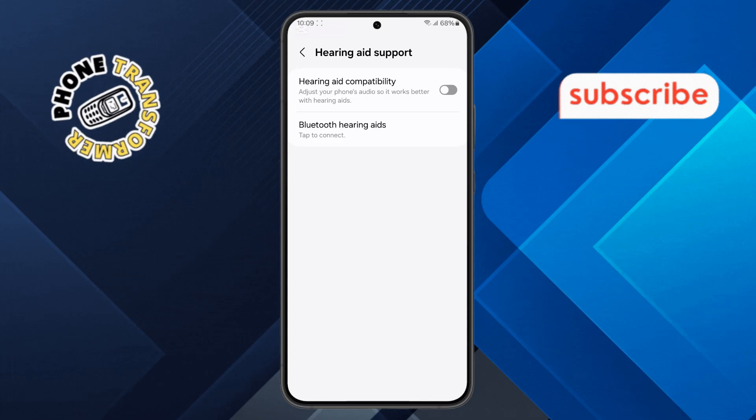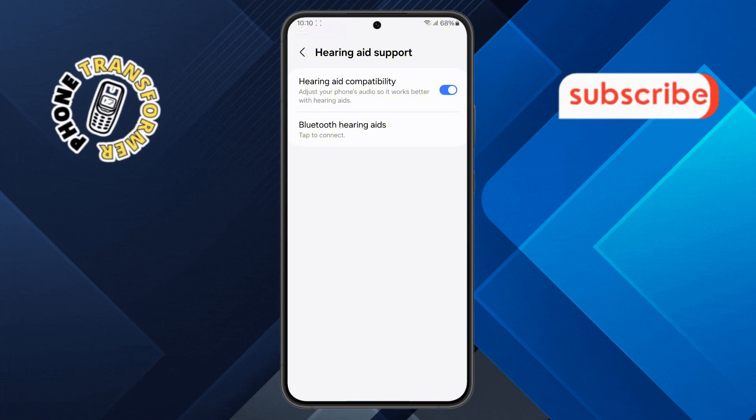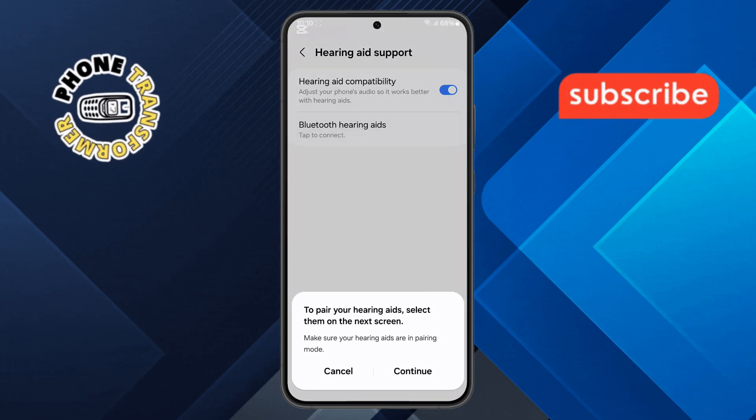Step 5. To enable Hearing Aid Support, simply tap on the Toggle button to turn it on. Once it's activated, you will see another option labeled Bluetooth Hearing Aids. Tap on it, then select the Continue button to move forward.